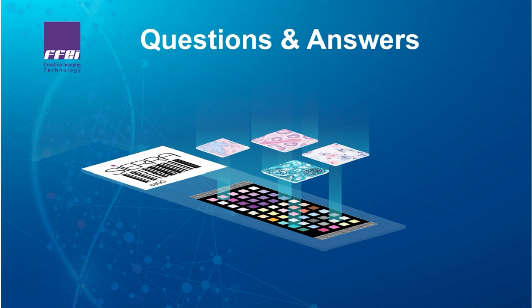However, if you have 500 from 5 scanners, for example, you would make 5 corrections, one for each unique scanner. Or perhaps if you were to have your 500 samples, but they've come over a long period of time from a few scanners, it would be most ideal if you could apply a correction that's most closely to the point of data collection. So it would largely depend on your actual collection method for those slides, but it does not require one profile per one image. Thank you.